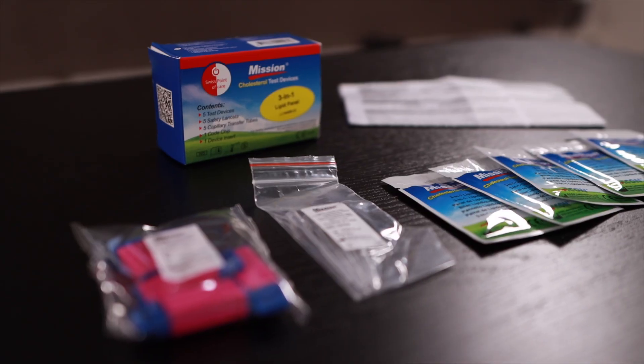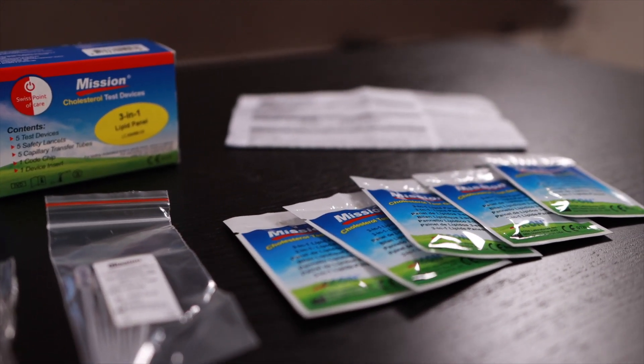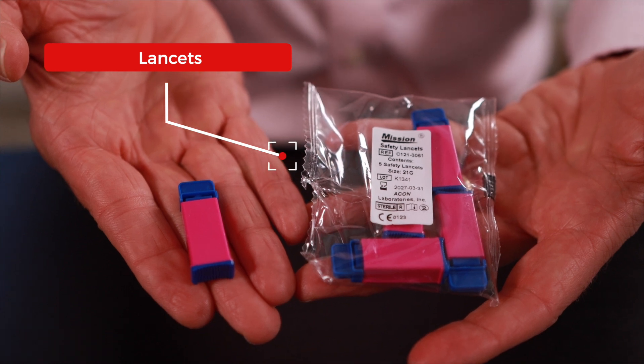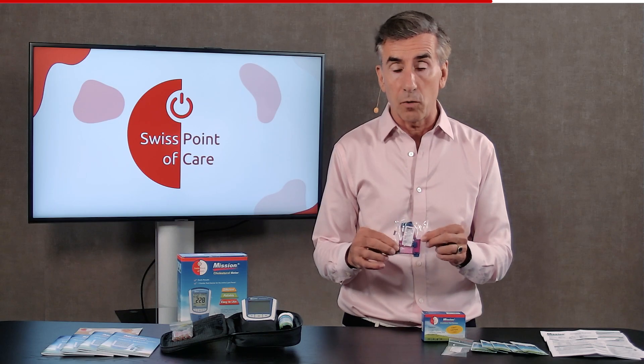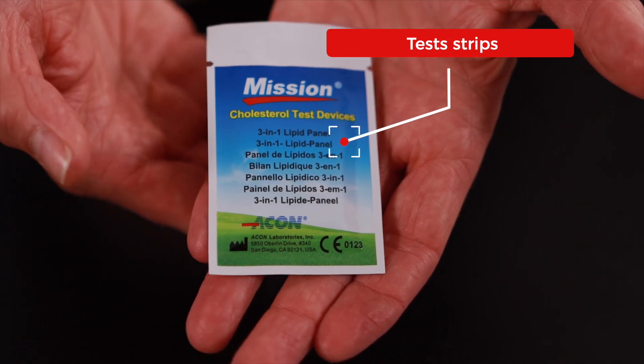On my side here, you'll find a little box with everything to do five tests. There are five pink-blue safety lancets — this is what you use to prick your finger. Then there are five capillary tubes, which is what you use to collect the blood. And there are of course five test strips, each packed in their individual sachet, plus the documentation that comes with it.